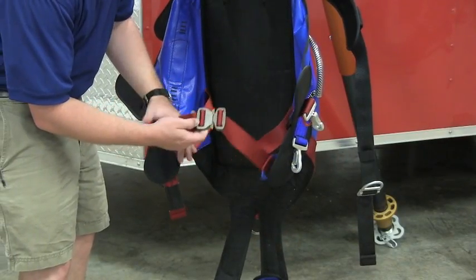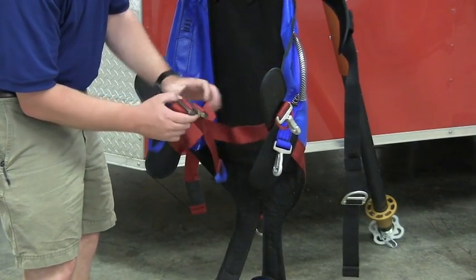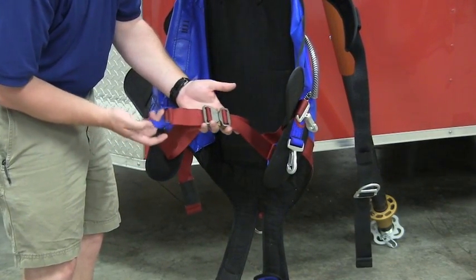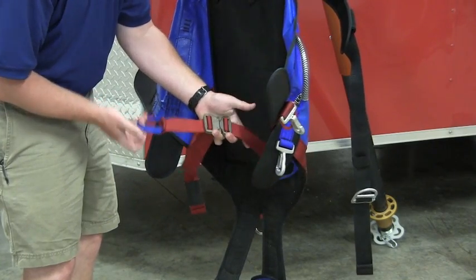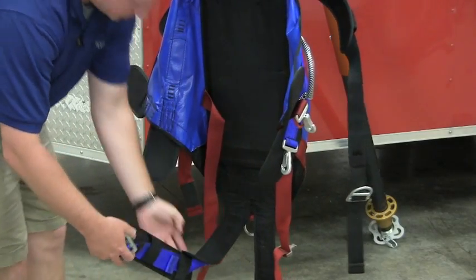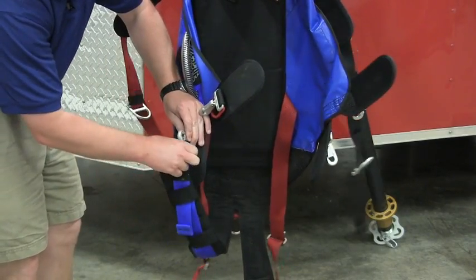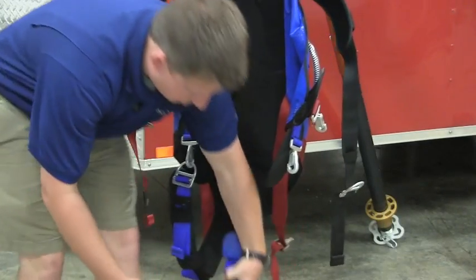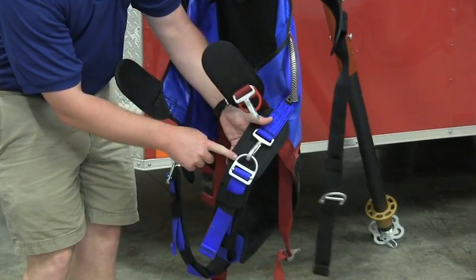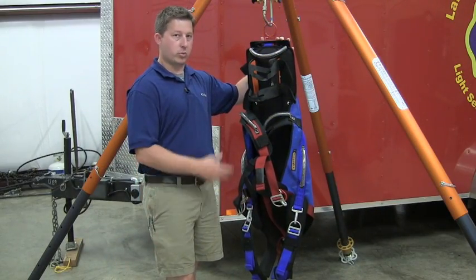As we work our way down, you'll notice there's a belt, and this is the first attachment point you would use to position the harness correctly on the patient, but it has a very easy connection point here. It's a really quick way to strap in the patient, and really nice handholds to be able to take the slack out of the device and cinch it around the patient's waist. Working our way towards the bottom, the leg loops just come across the patient's legs, and each leg goes through a leg loop, but you'll have blue and another blue one. So both the blue on the bottom are your leg loops, and this padded area protects the patient from the couplings and the adjustments. Now we have all of our connections made, and this is what it would look like when it's on the patient.